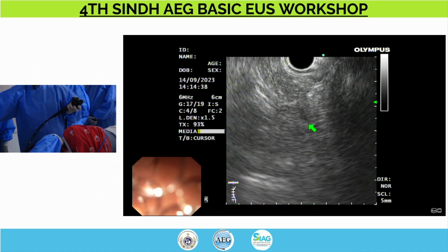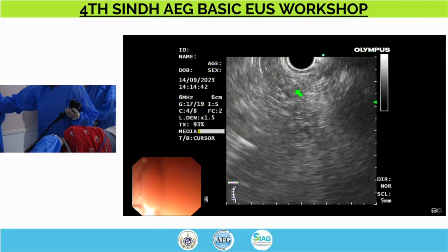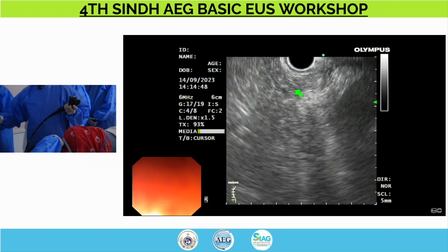Right here. You see that? Kambis, any comments? You can see that? Very well, Dr. Hassan. Okay.